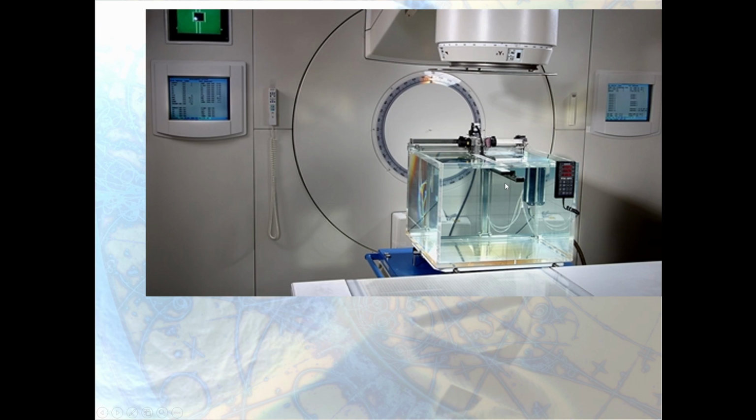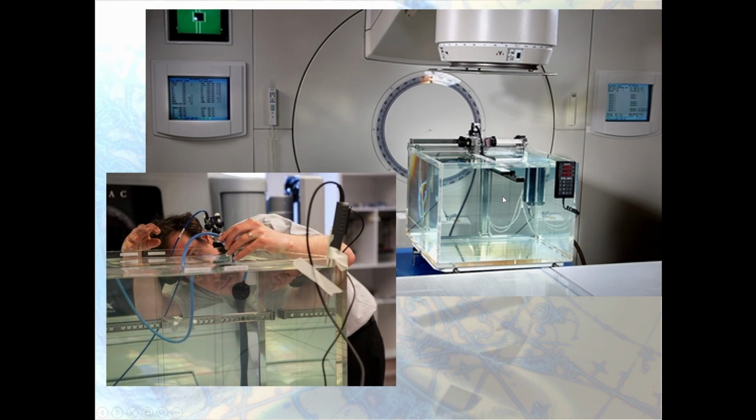How do you use it? Well, you take your water tank and you align it. You have to be very accurate. You align it, you center it under the linac head. And there you see a person doing this very accurate measurement, but at the beginning they need to put in place an ionization chamber.